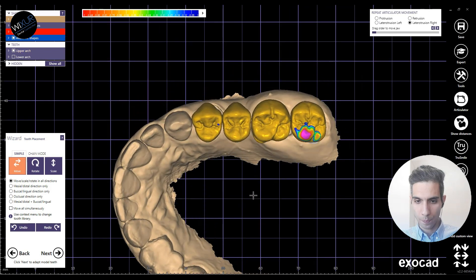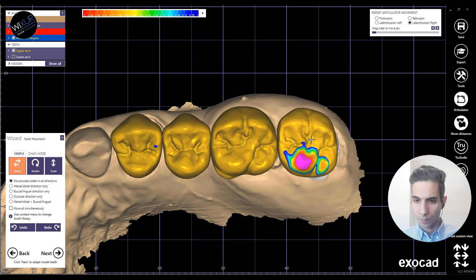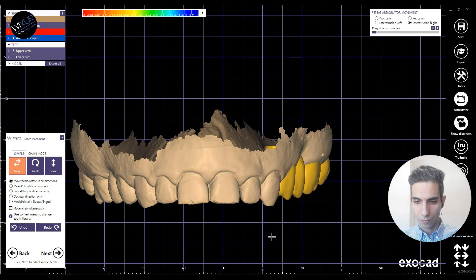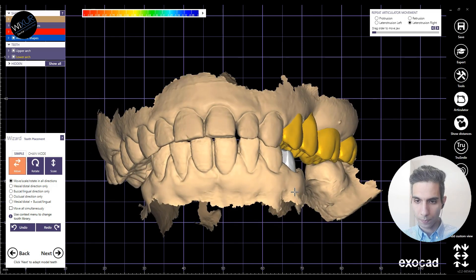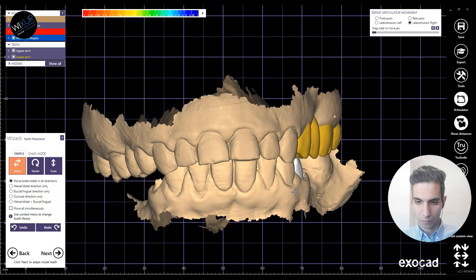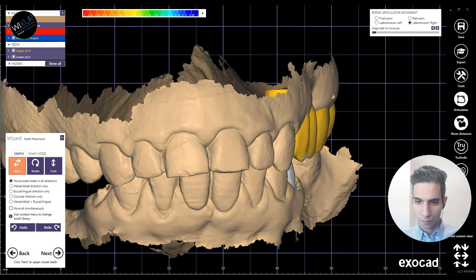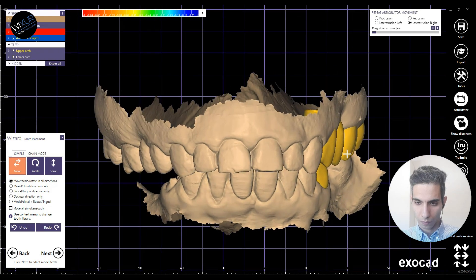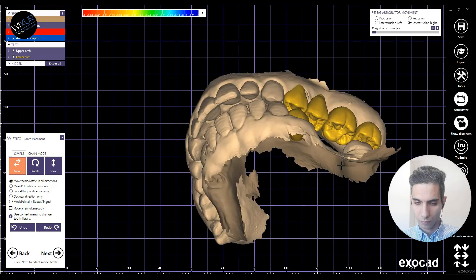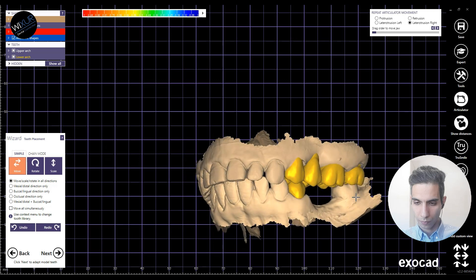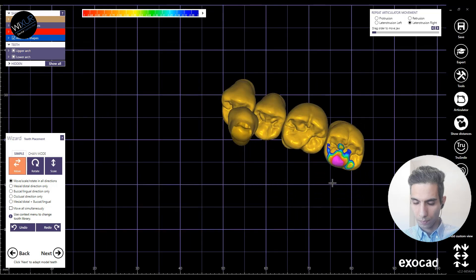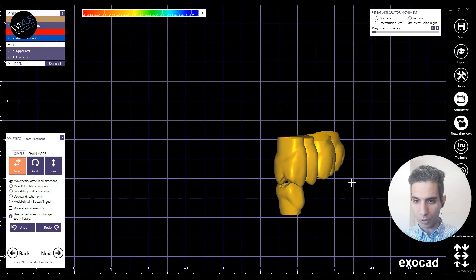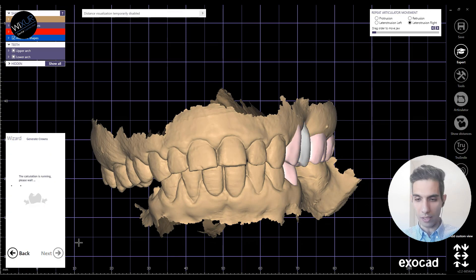Making them a bit smaller — that looks almost fine. Now the show distance feature is also enabled, so I can see how this lingual cusp of the second molar is in intersection. Click next, let's see what happens.